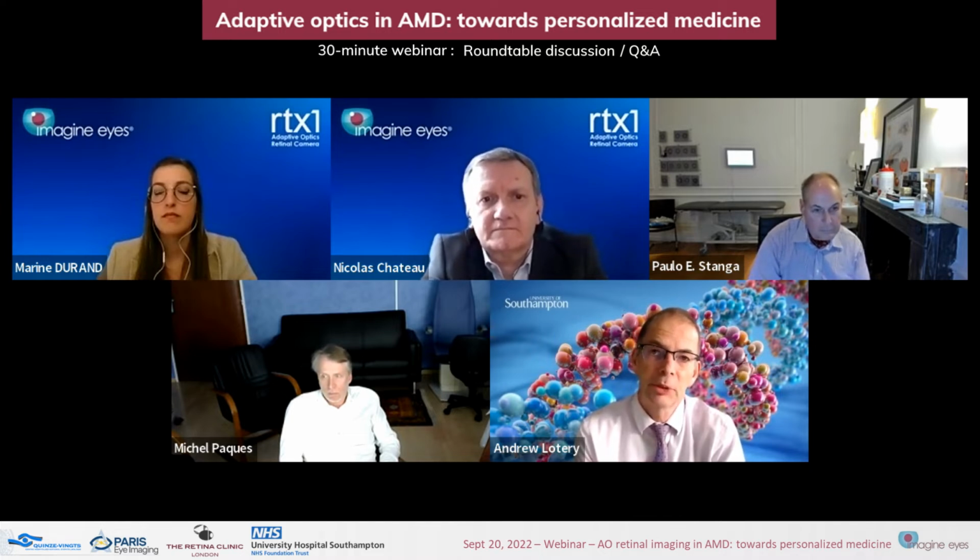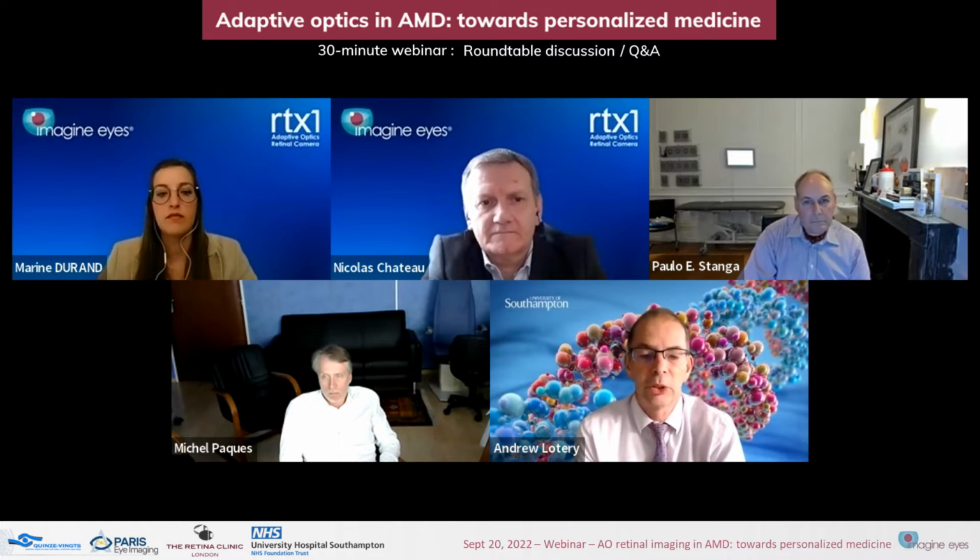So adaptive optics is something that we're looking at to see if it can identify these early structural changes that would be useful in future clinical trials as endpoints.